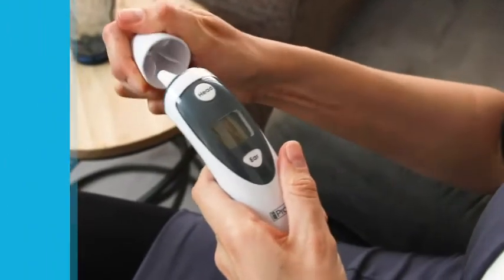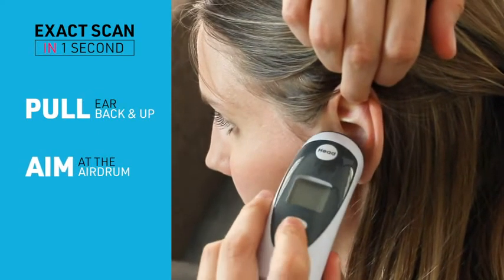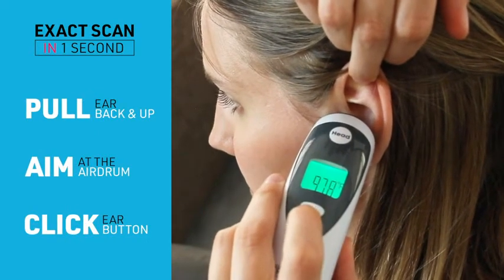Measure via the ear in 1 second. Pull the ear up and back. Aim the probe at the eardrum. Click the button and read the temperature.